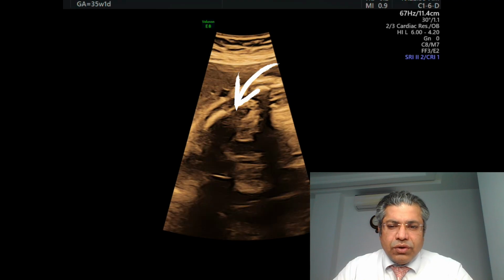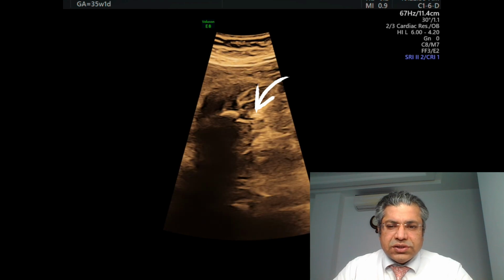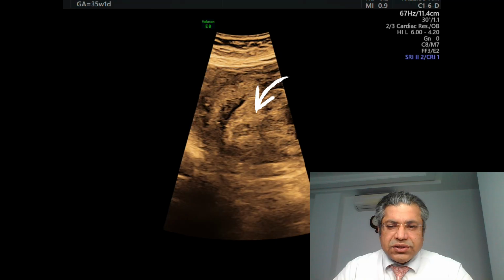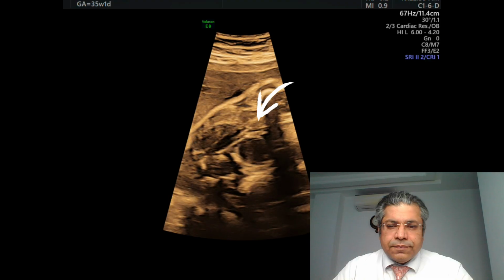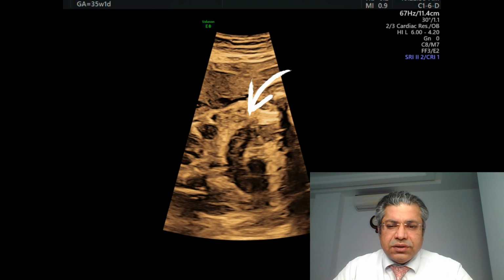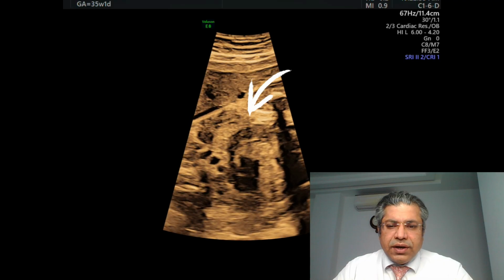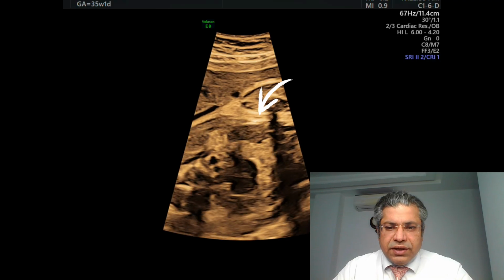So this is the sigmoid, and overlying is this. We don't see any movement of the meconium in between, and no peristalsis. So the gut is lying listless, absolutely. Again, we are focusing on the rectum, and that was the anal pit, and then the sigmoid colon, right? So that is what it is. This looks like it could be paralytic ileus.